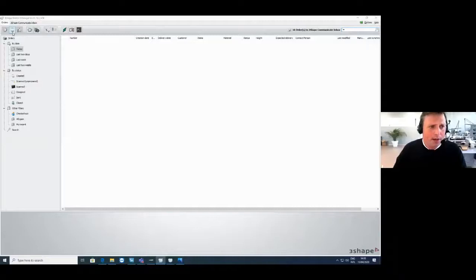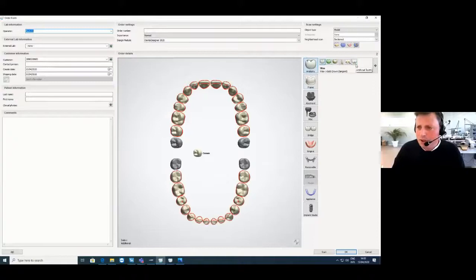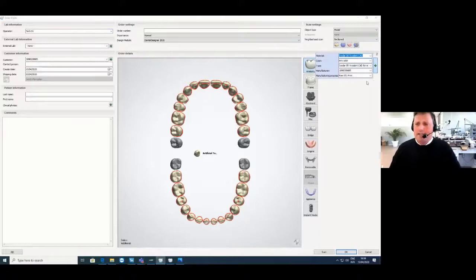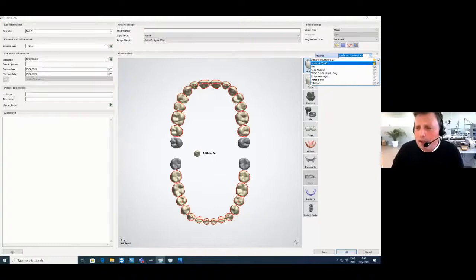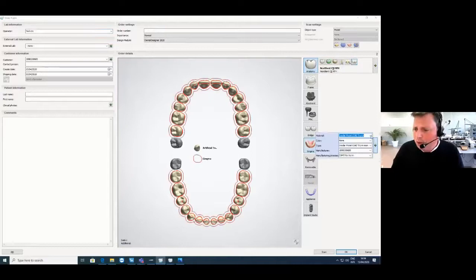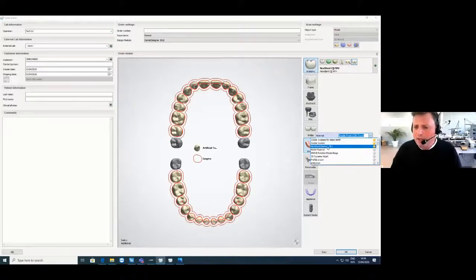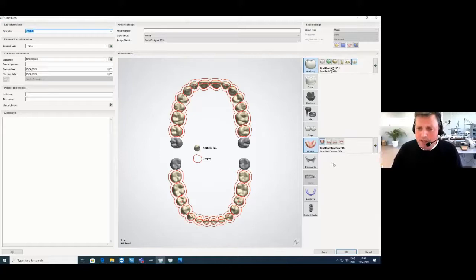We start by setting up the order form: select teeth 17, shift to 27, press 37, shift to 47. Then choose anatomy, select artificial tooth, and download the DME files from the NextDent 3D Systems website to get the perfect parameters for the right material. Here I choose the NextDent crown and bridge MFH material. A great feature in 3Shape 2020 is that you can highlight favorites in your materials list. I set the color, and then choose the gingiva, selecting the NextDent Denture 3D Plus material in opaque pink.